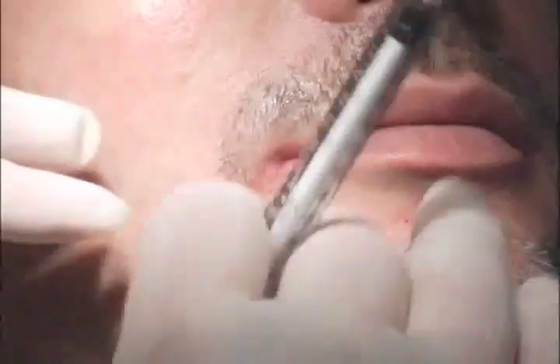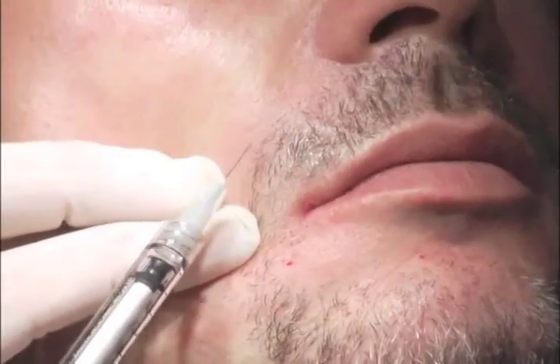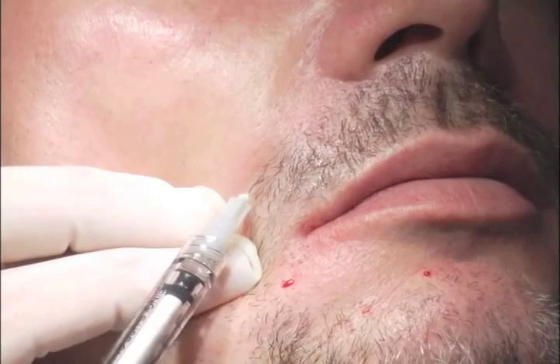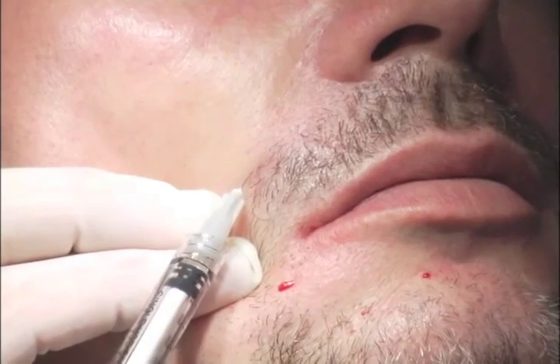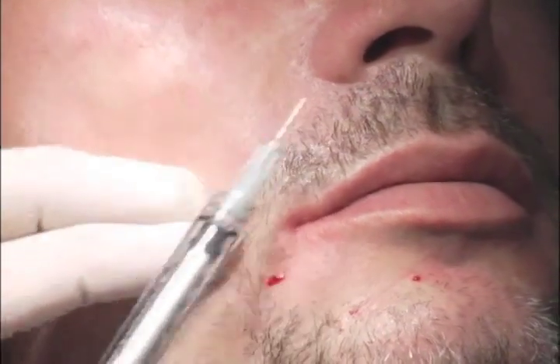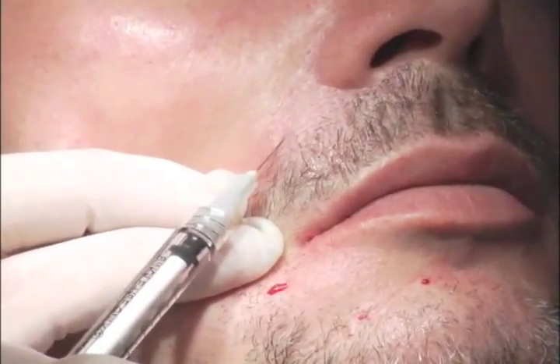Now, what you have to know is when you bring out the lips in that manner, it will flatten the nasolabial fold. But you still have to add a drop over here, anterior, slightly anterior to the fold, though I sometimes inject on top of the fold to flatten it out. Again, the key thing is to do this slowly and have a firm surface to inject against, because what you don't want to do is you don't want to skewer the patient.